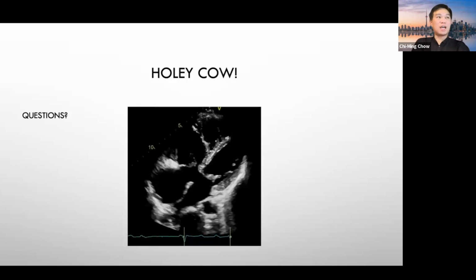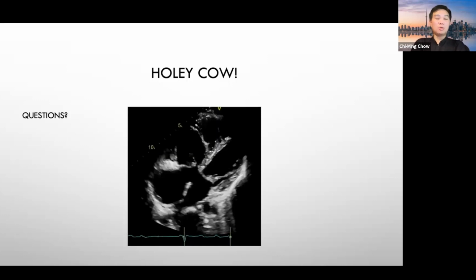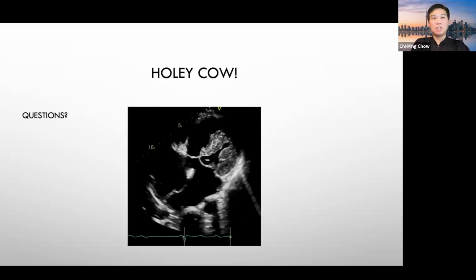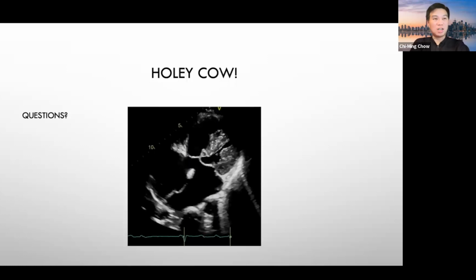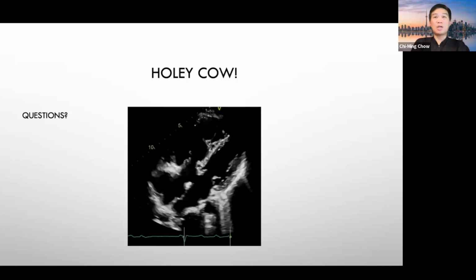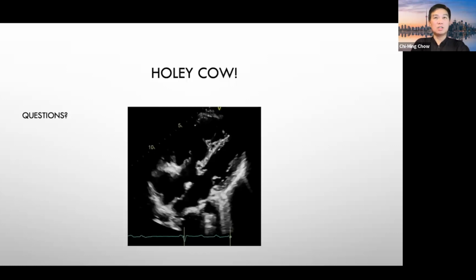The challenge of that is, we're very lucky at St. Mike's that we can do this quite easily. Almost all our sonographers are trained to be able to put in IVs and give agitated saline contrast plus echo contrast. It's not the case in the community. So they don't always have the opportunity to do the agitated saline contrast study or IV, things like that.